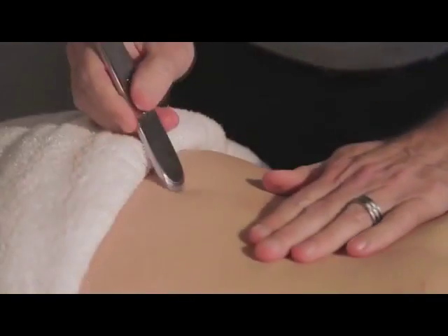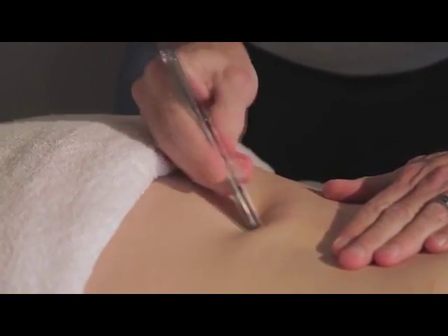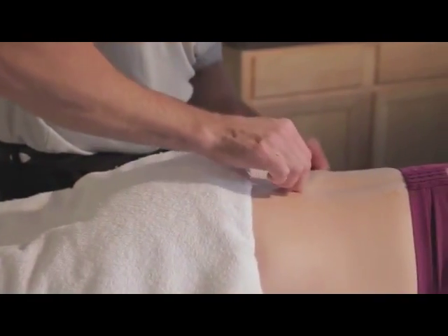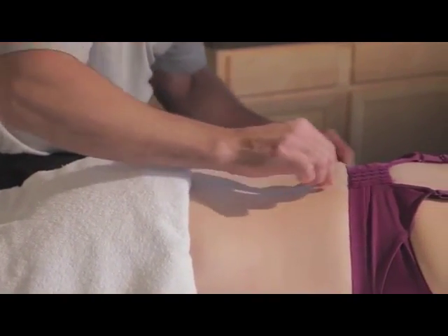It could be uncomfortable, but I would say that Graston technique is actually more comfortable than what is traditionally done with a therapist's hands or fingertips. The treatment edges are very precise, and it allows the clinician to treat this tissue much more specifically than what they typically could do with their own fingertips. So it really is a more comfortable intervention than what is traditionally done manually.